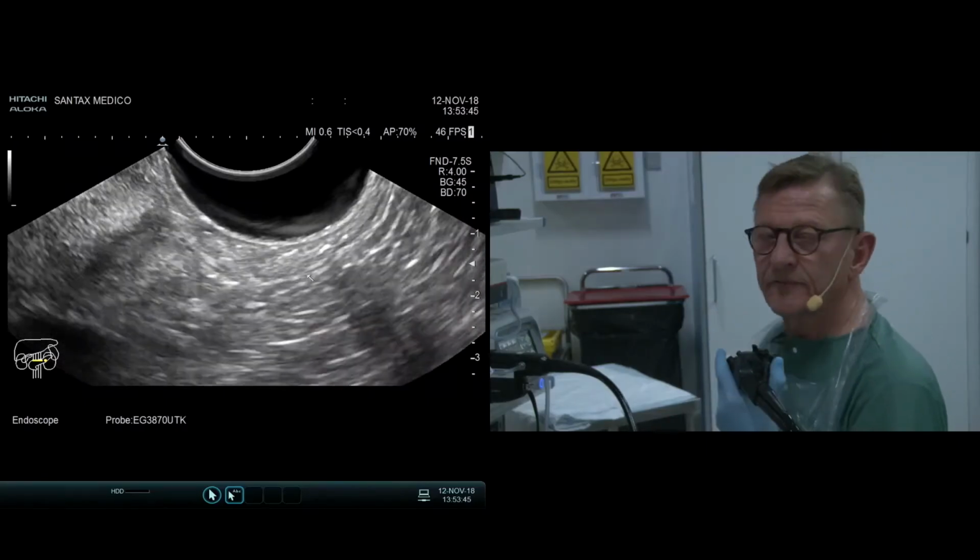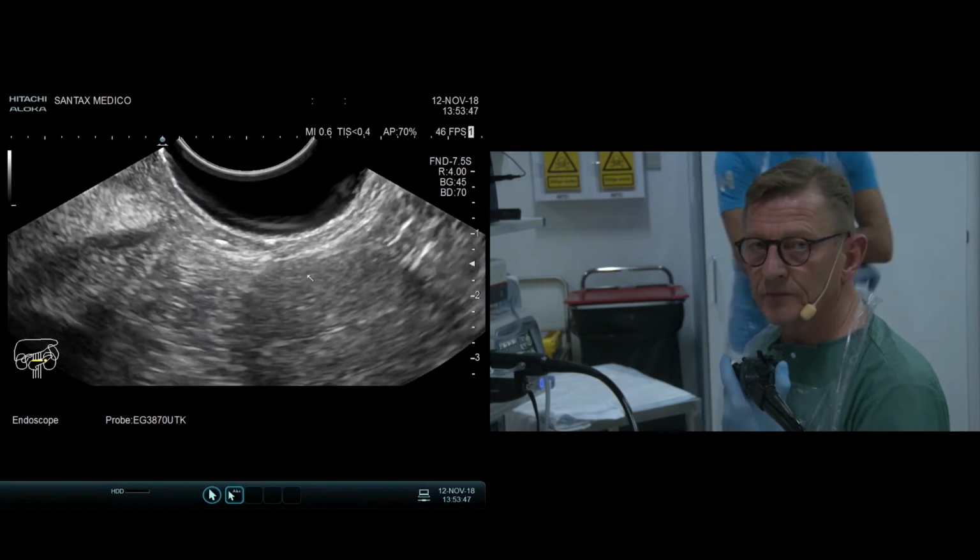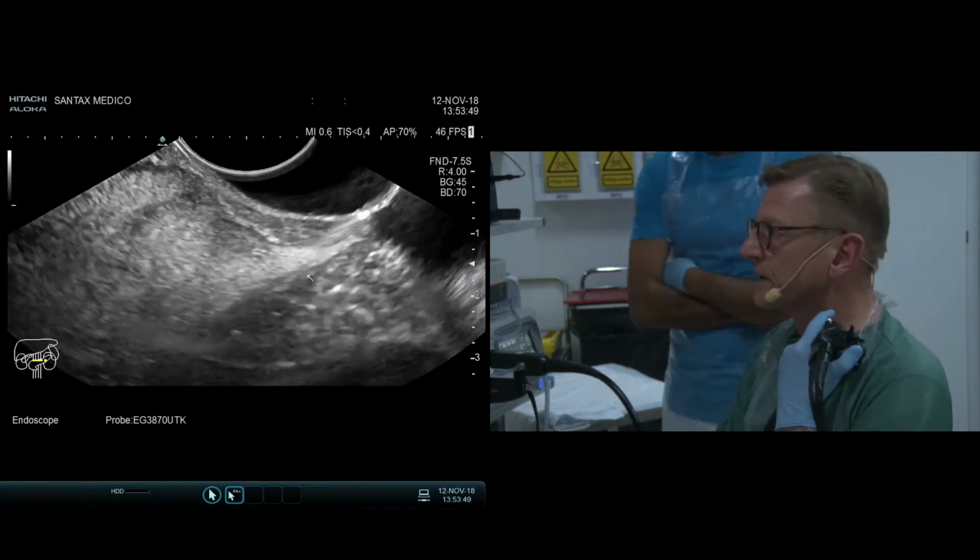How long are you staying in the cyst? There were some initial concerns with NCLE, and the initial report stated that you should stay less than 2 minutes, or 1 to 2 minutes when doing the imaging with NCLE. Would you respect that when using the microbiopsy? Yeah, usually it doesn't take very long to do the microbiopsy. It is very, very quick.